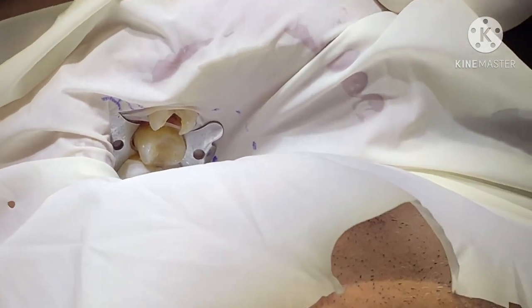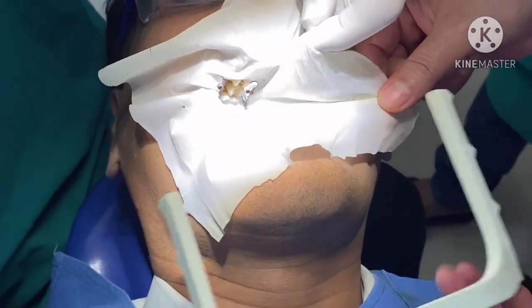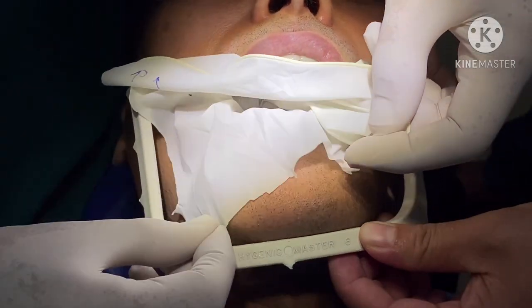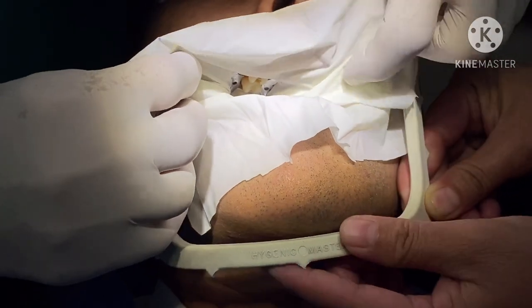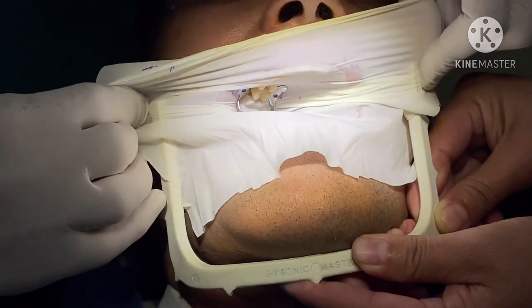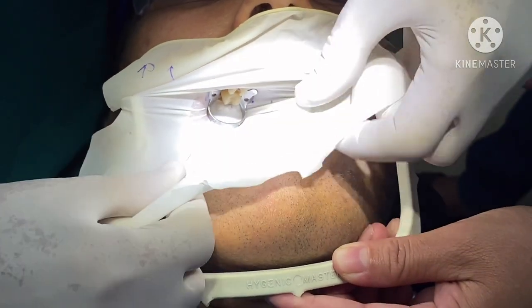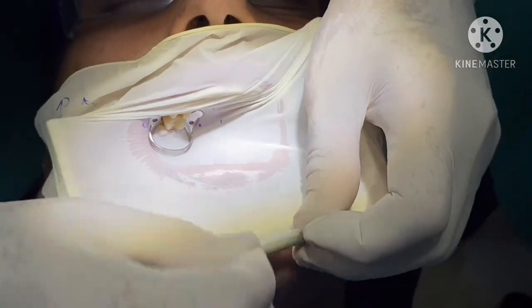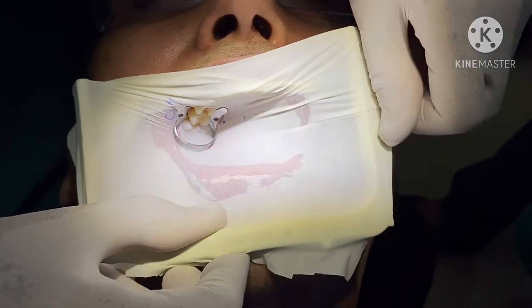Then is the application of the rubber dam frame. It is held below the rubber dam parallel to the upper lip. And the stretch of rubber dam that falls on the most superior hooks, we hook it bilaterally. Similarly, we hook it on the other side, then the rest, and we fold the extra portion like this.